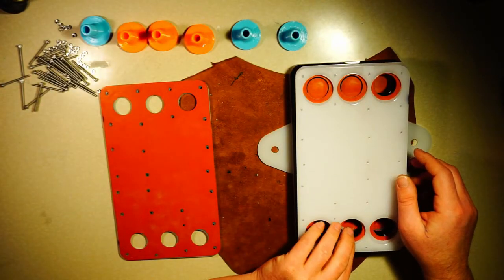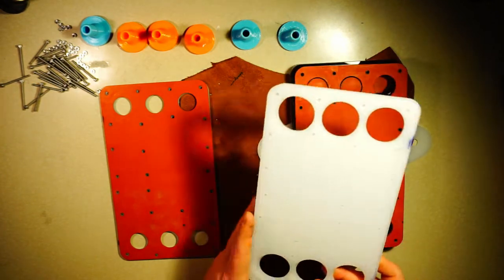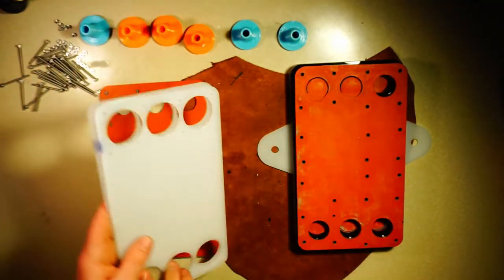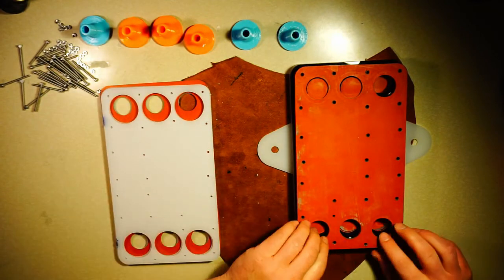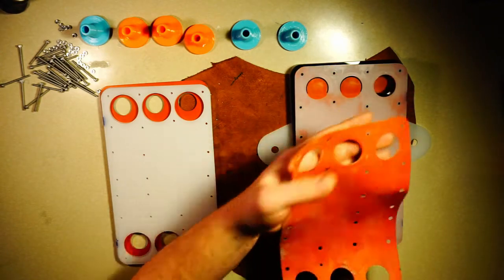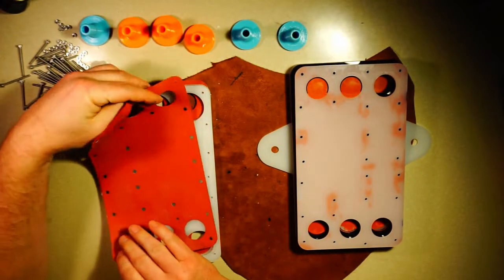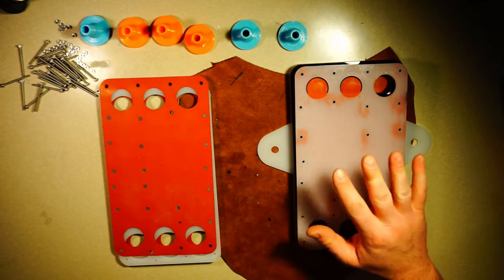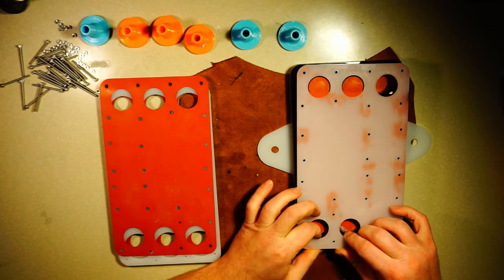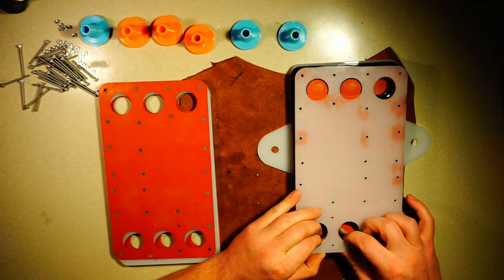Okay, so the next thing we have is 6mm of plates that just space where the ports go. Then we have our first seal. These seal the bottom of the ports. Again, this is just a gasket, not a membrane. Now we start getting to the interesting parts of what goes on in the valve. So we have this top plate of the valve, excluding these port mounting plates.